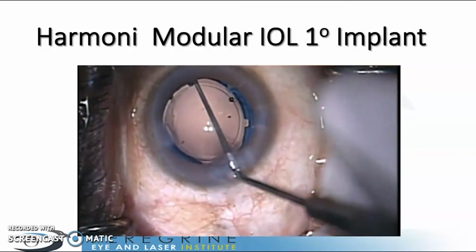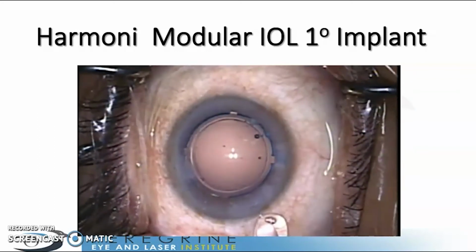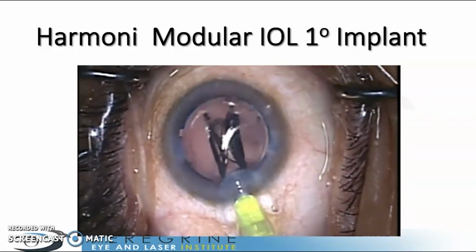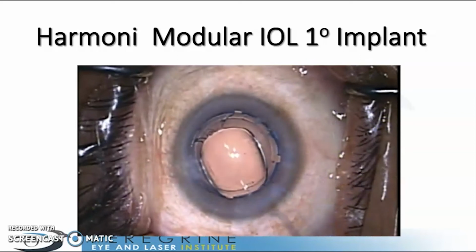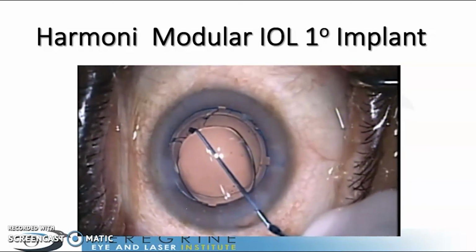And just imagine it to be like a donut, only that there's a groove within that donut, and you will attach the optical component into this groove. Okay, the lens has been designed so that it's very easy to see the groove, which serves as a landing platform for the optical component. So the leading edge has two ears which attach very easily into the groove.